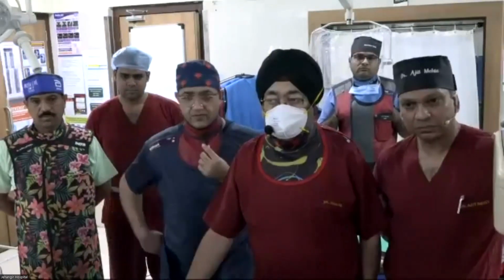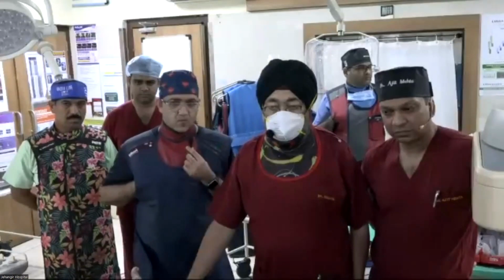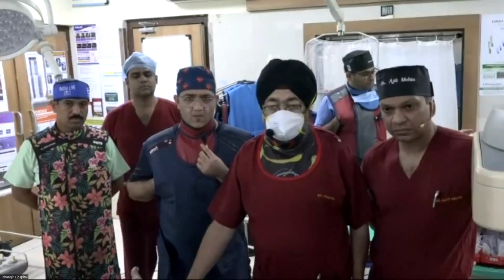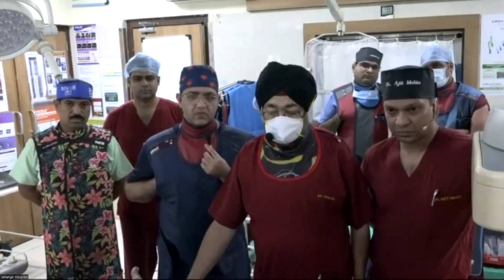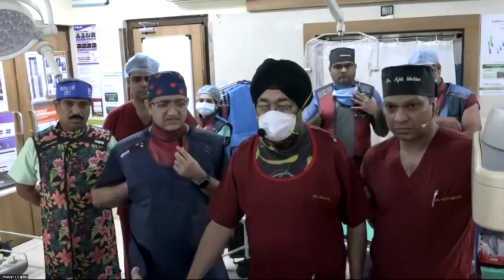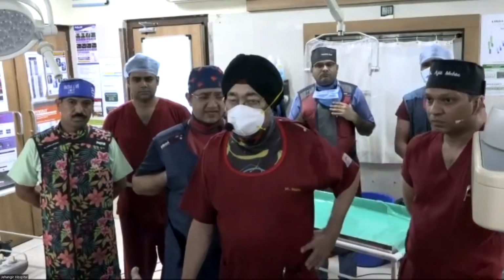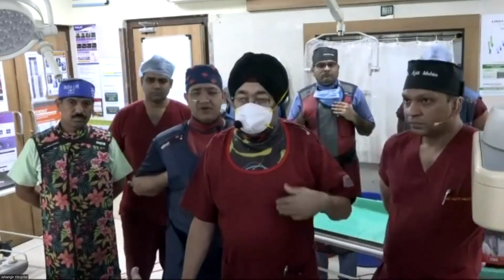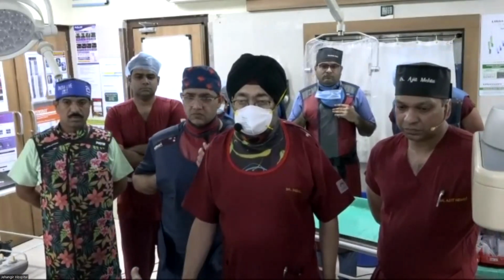One last question to Dr. Duggal, I want to ask because it's an eruptive nodule. So we expect the TLR and the TVR and MACE will be higher compared to the non-eruptive nodules. Yes, long follow-up has demonstrated that. Yes, this is the typical character of eruptive nodule. Acutely, they settle down easily, but they may come back, even come back inside the stent again. Yes. But I think, remember, these are all observational data.